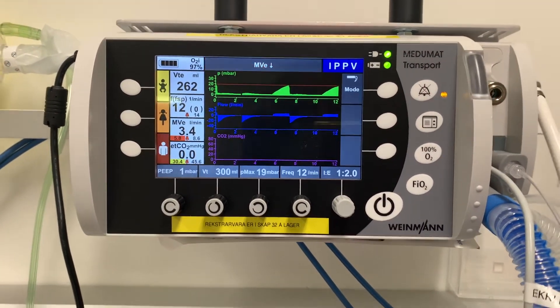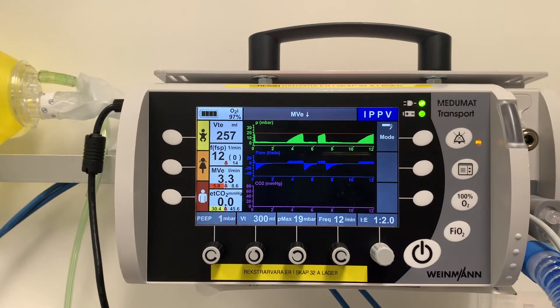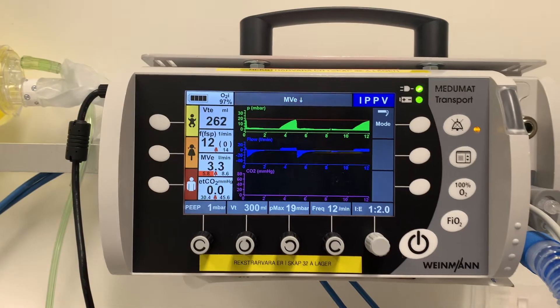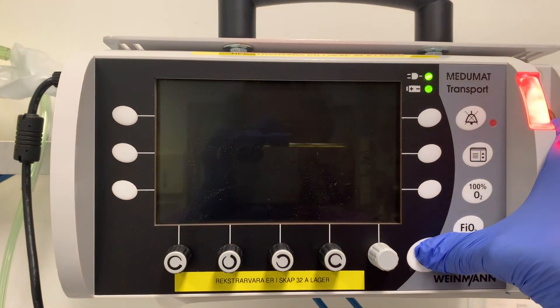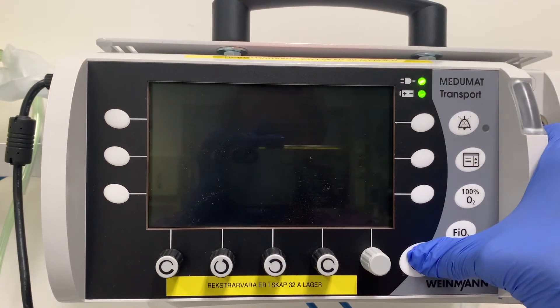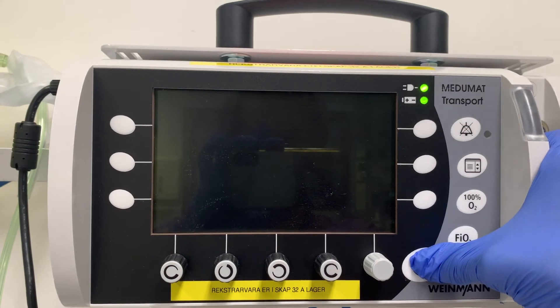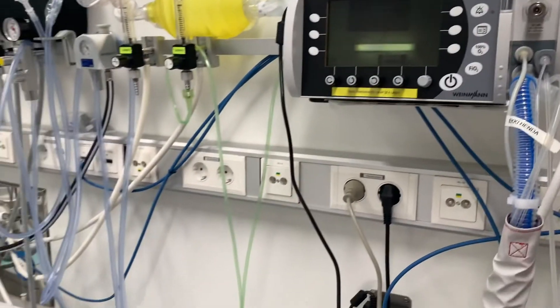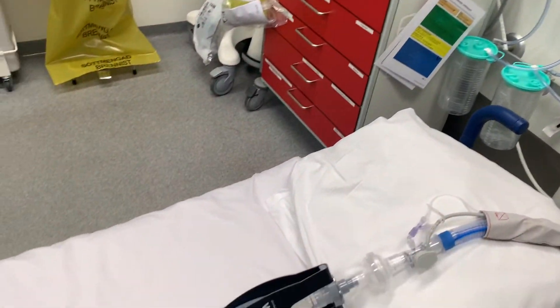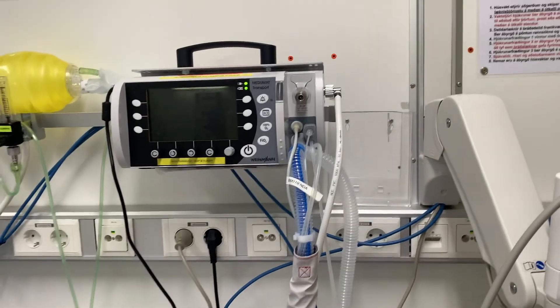To shut down the machine, pressing once puts it into sleep mode. To fully shut it down, hold the button for about five seconds until the red light goes off. If it was just for a function check, disconnect the lung test and put it back on the wall where it was.